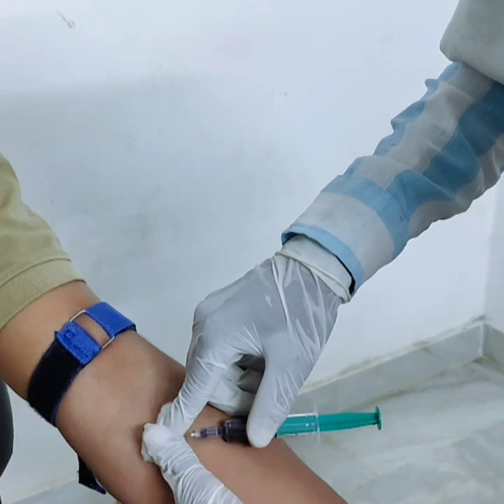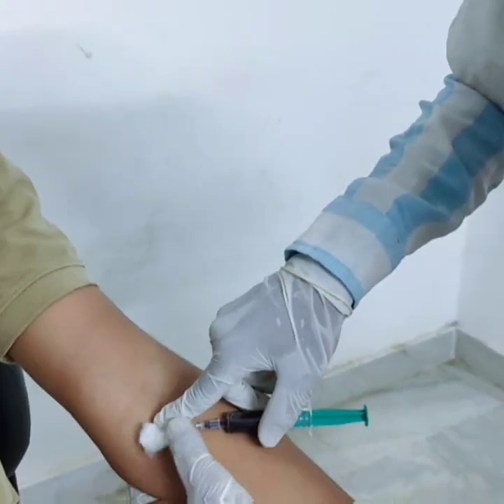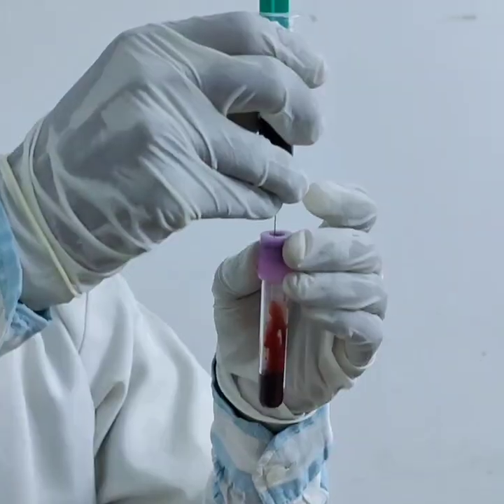Once you have collected the blood, remove the tourniquet first, then gently withdraw the needle. Finally, thank the patient and label the sample correctly with name, date, and time.